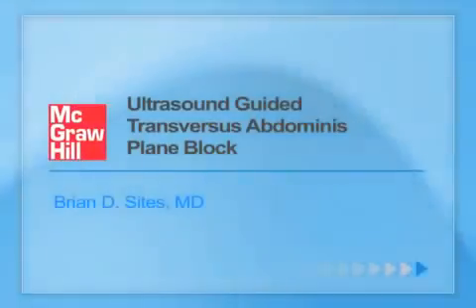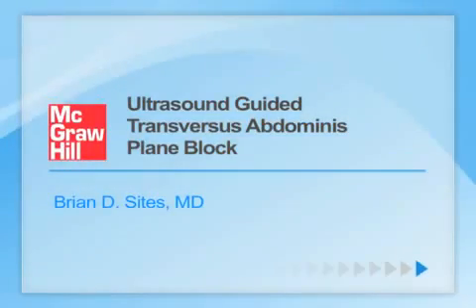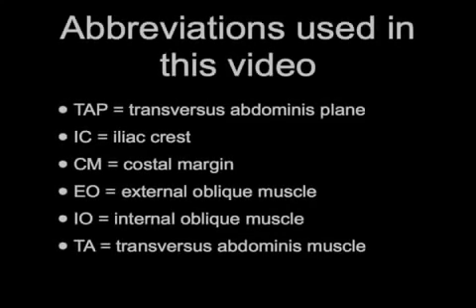Welcome to ultrasound-guided transversus abdominis plane block. There are several abbreviations used in this video. Please note them here.